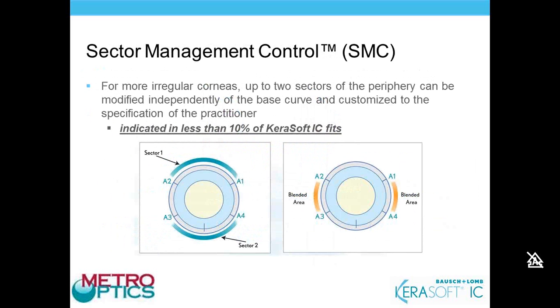Sector management control is this feature where you can change the periphery in two different sectors. And again, while this all seems complex, it's a great tool when you need to customize for your patient. This is indicated in less than 10% of fits. So this is something I rarely use, but it's great to have, in particular in those patients where we have fluting, like in those corneal transplant situations. So the sectors, the width of the sector is determined by these angles.